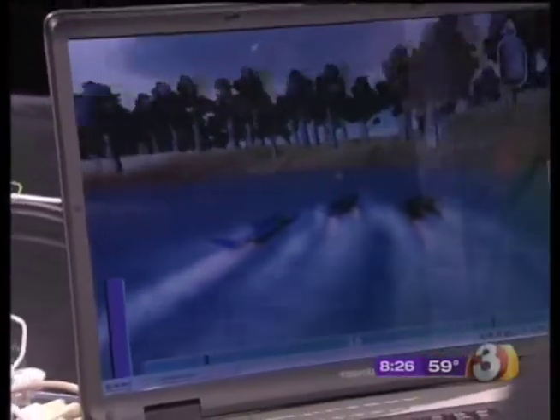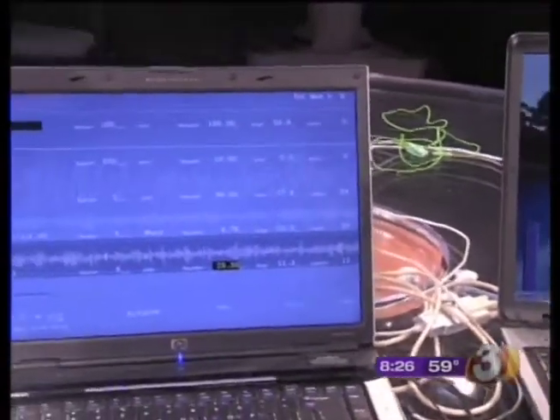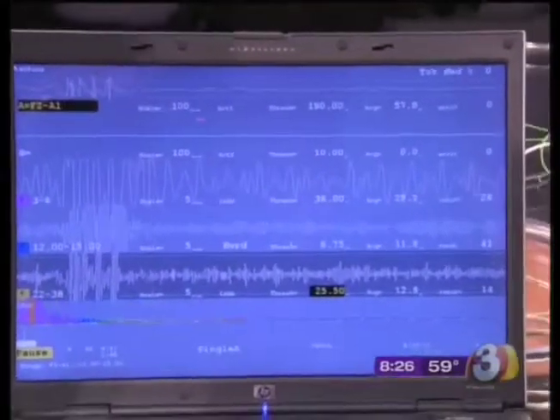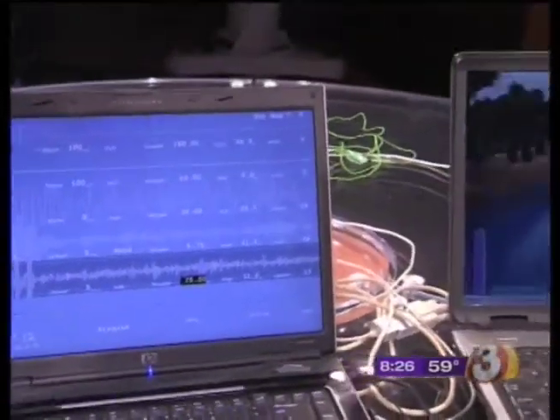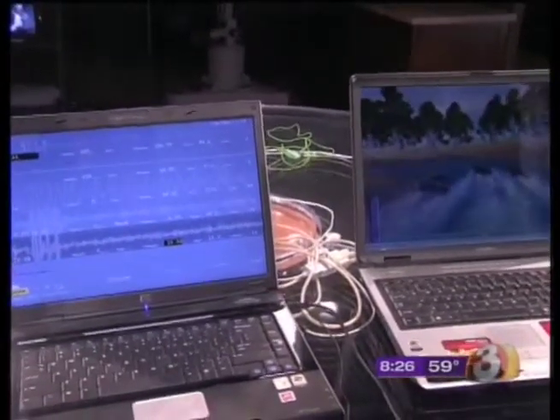No, it's reading his brain activity in his frontal lobe, which has to do with our executive functions, such as focus, control of impulsivity, sustained attentional abilities, reacting emotionally appropriately, not overreacting. It's kind of the conductor up there. Can this treat addiction? It is used for addictions too, yes.